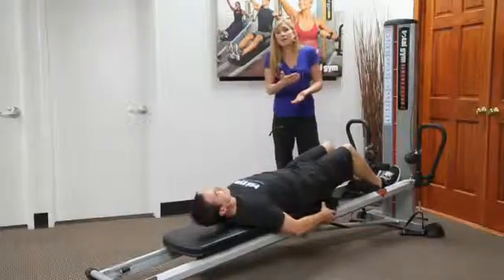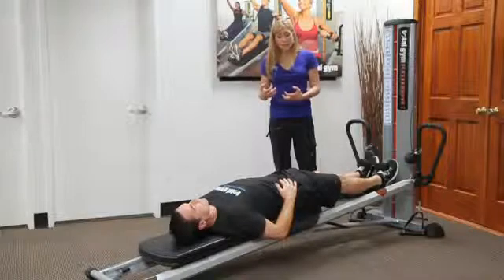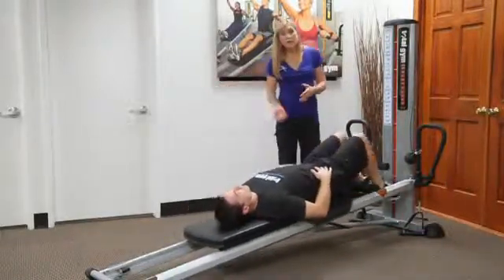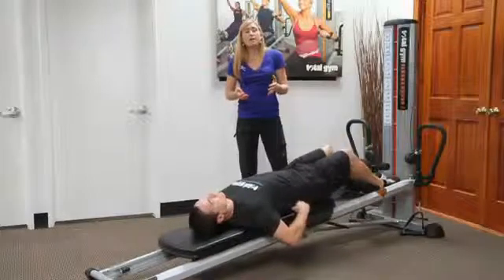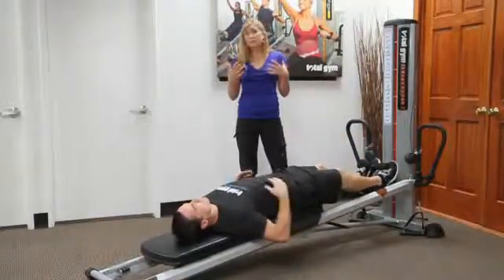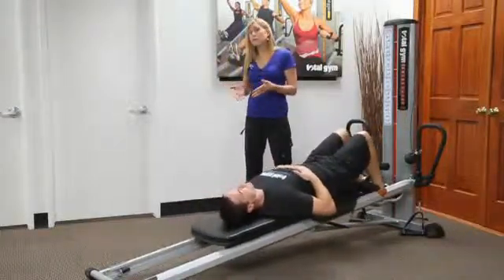Now with that said, if they have an injury or anything like that where you're trying to limit the range of motion, then what you might do is bring them to the bottom. And outside of the strength, mobility, and awareness section, I do want to bring up one factor, which is this: you are inverted. And for some people, that is very uncomfortable for them. They might have glaucoma, blood pressure issues, acid reflux, whatever it may be, that doesn't allow for them to feel comfortable in an inverted position.